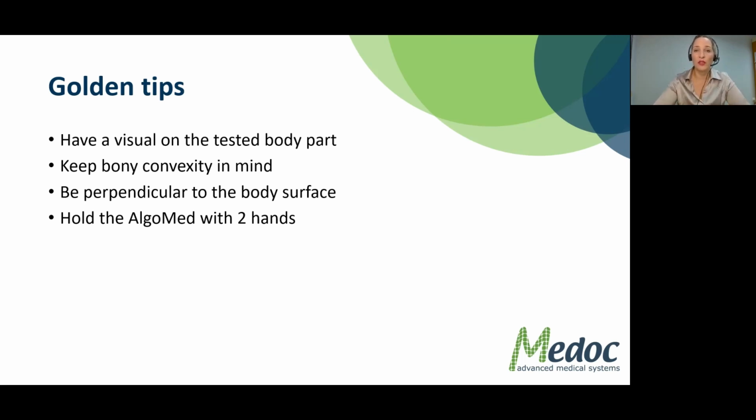If the skin is burned, the skin will also be painful. And then what is it that we're measuring? Because the skin will start hurting as soon as we are applying pressure to it, and maybe we should reschedule this person when we see a situation like this. So these are two reasons why you should always have a visual of the skin and the body part.